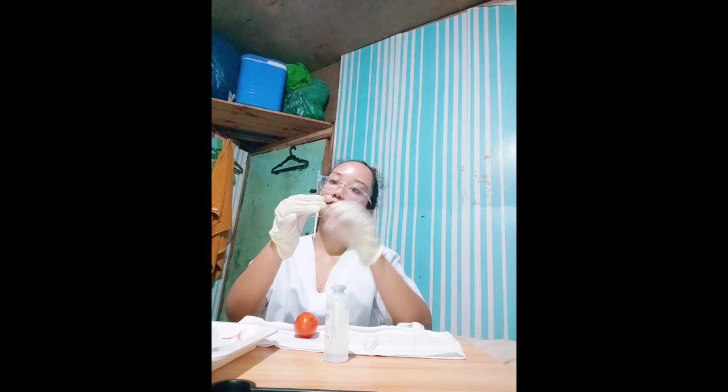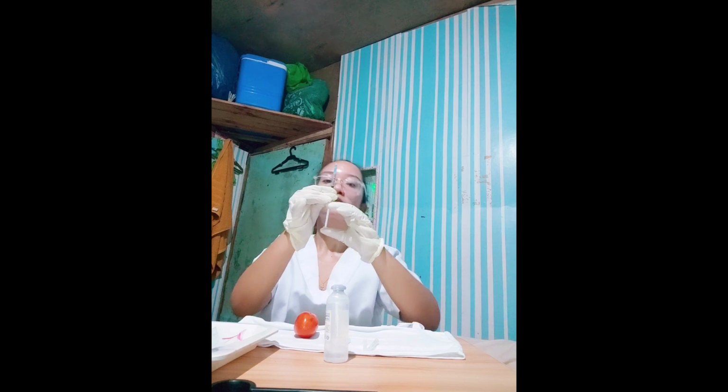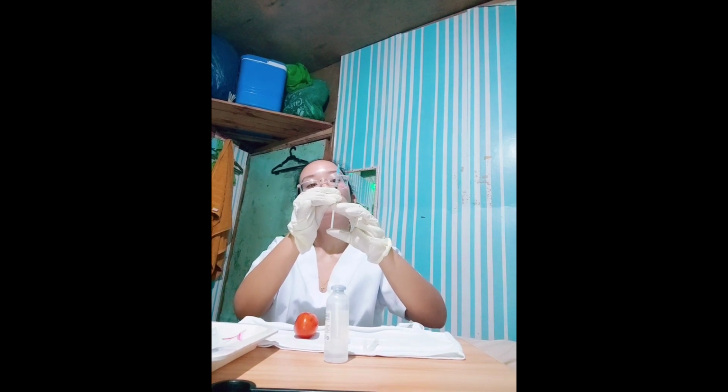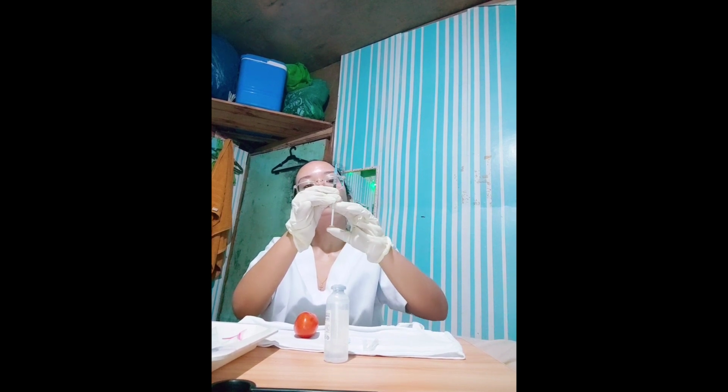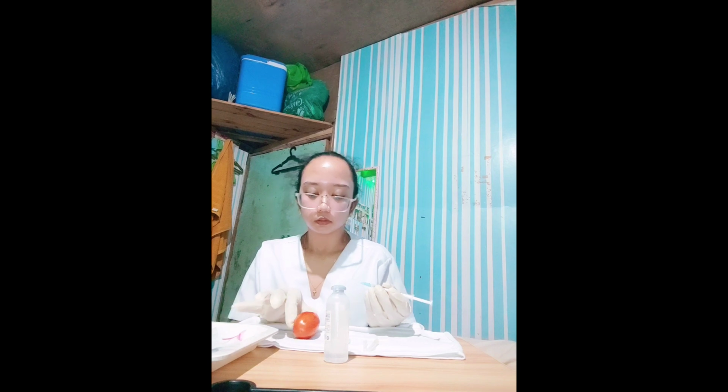So we will remove the excess bubbles. Okay. So we will inject the subcutaneous tissue at a 45-degree angle.